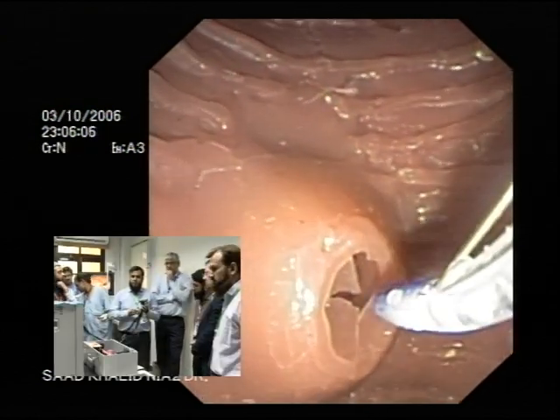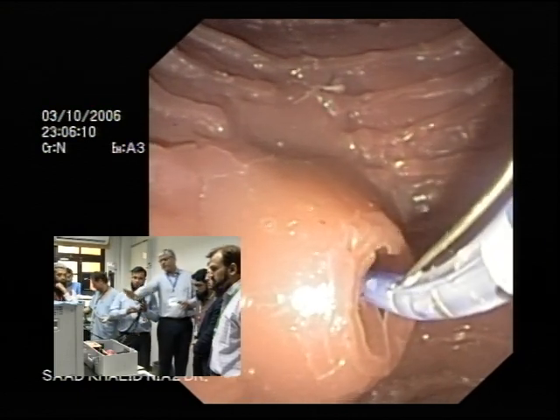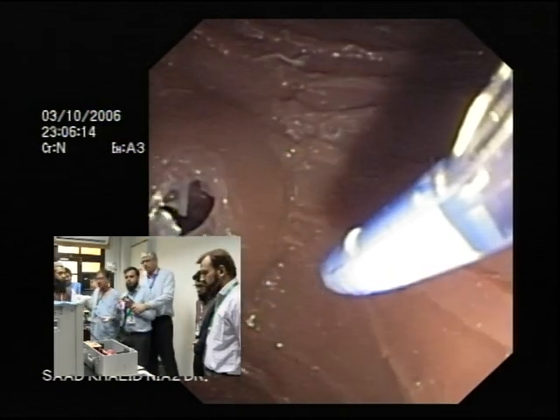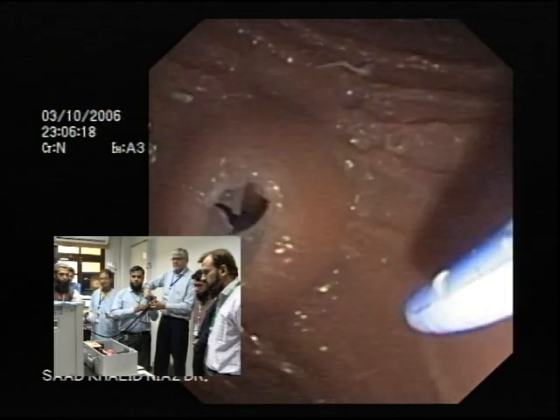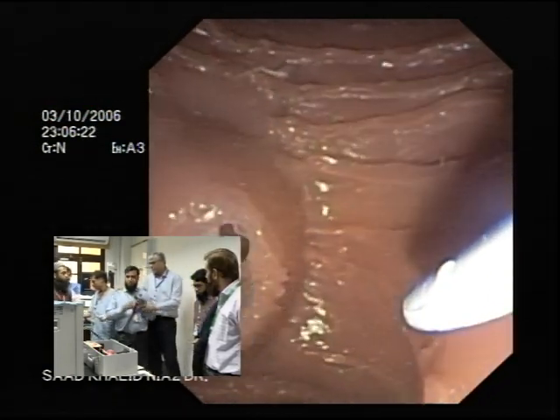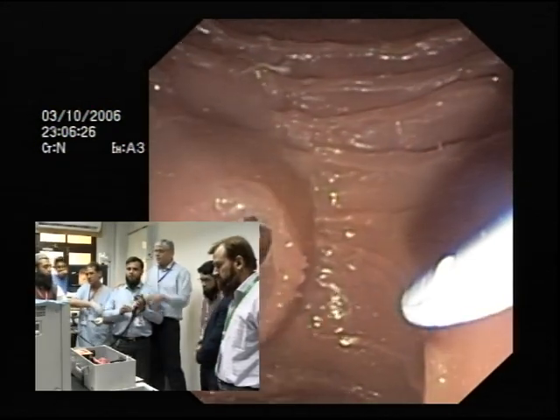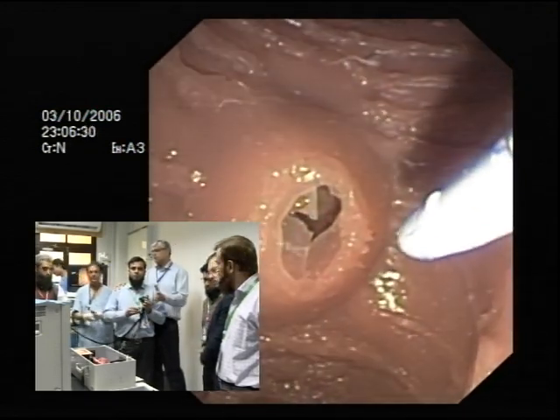Okay, so if you want to bring it facing towards you, look, you've got two options. One option is doing this. The other option is, wapas isko jaane do, the other option is this. So you have two ways of actually bringing your ampulla right or left. You can use the torque, which is what he's doing, or you can use the small wheel.